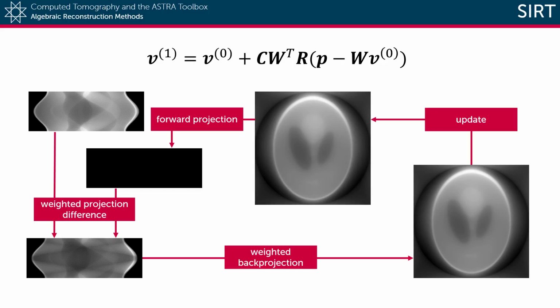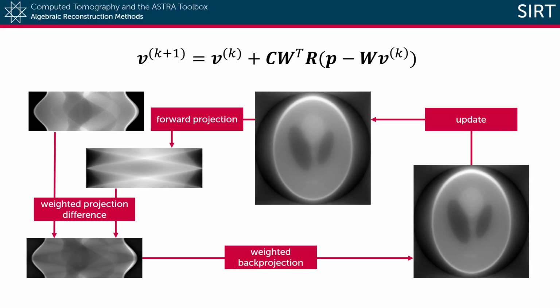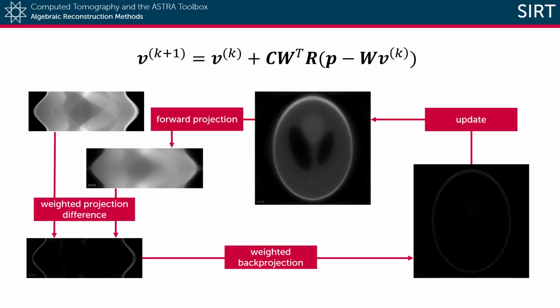This process is then repeated, and you will see that by the end of the second iteration, the result will be improved quite a bit. And if we keep on iterating, we will eventually converge to a nice reconstruction.